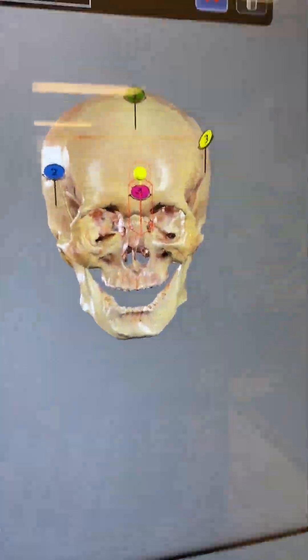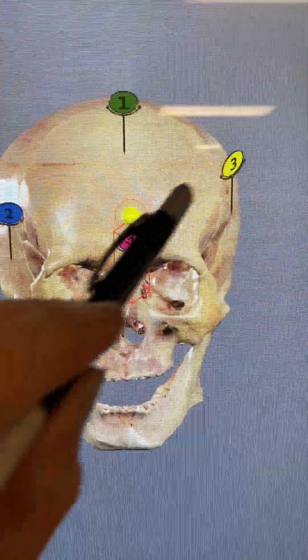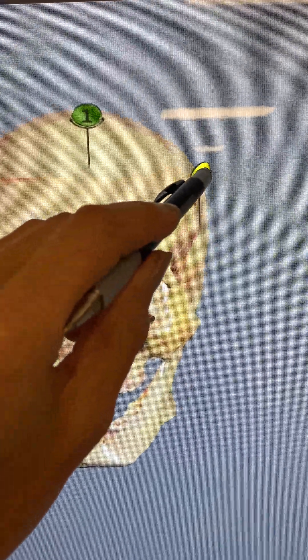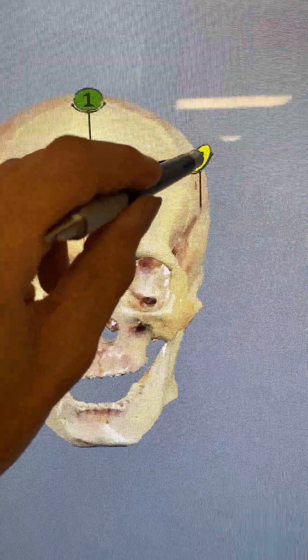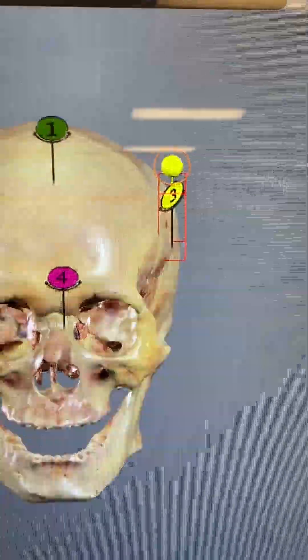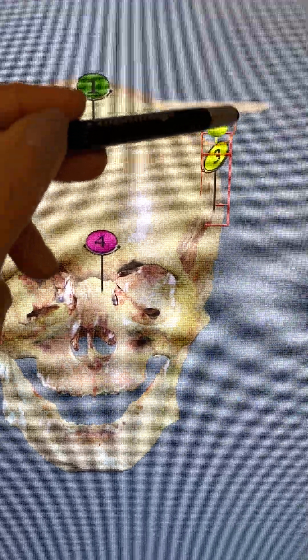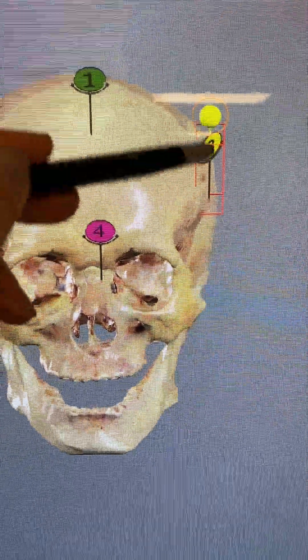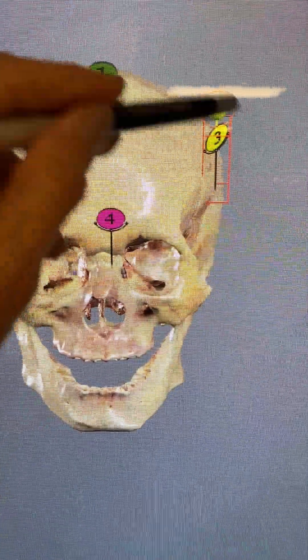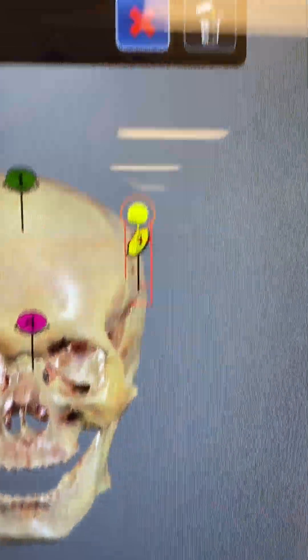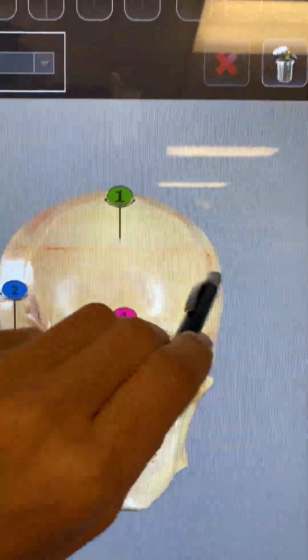Let me tell you something before I explain more. By tapping on each pin, you can remove them. When you see a red box coming around and that yellow ball on the top, I'll tell you what this is doing. But when this comes up, you can just click here and remove it.